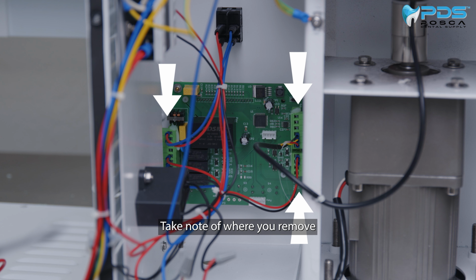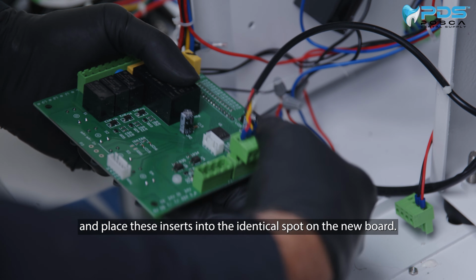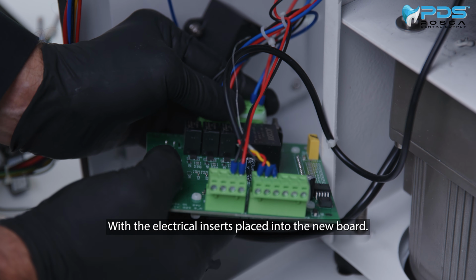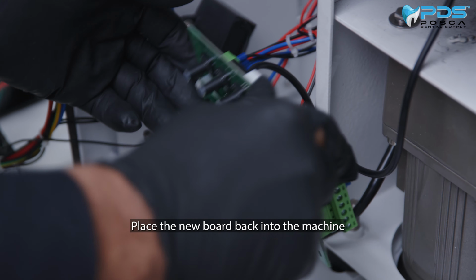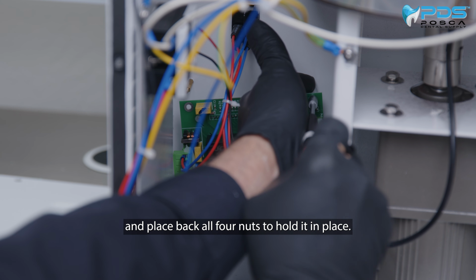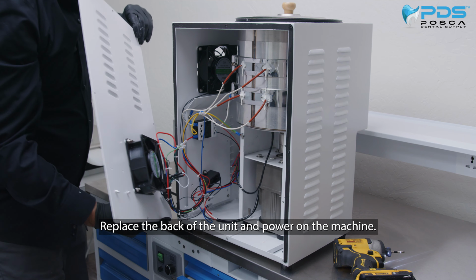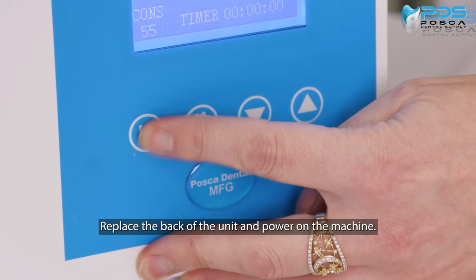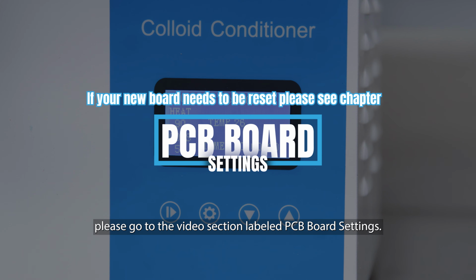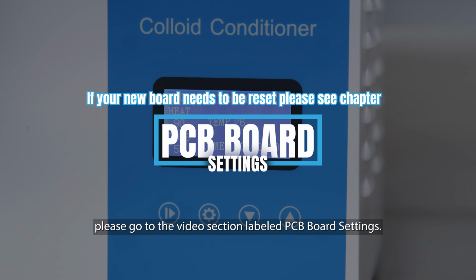Take note of where you remove the electrical inserts from the old board and place these inserts into the identical spot on the new board. With the electrical inserts placed into the new board, place the new board back into the machine and place back all 4 nuts to hold it in place. Replace the back of the unit and power on the machine. If your new board's program needs to be reset, please go to the video section labeled PCB board settings.